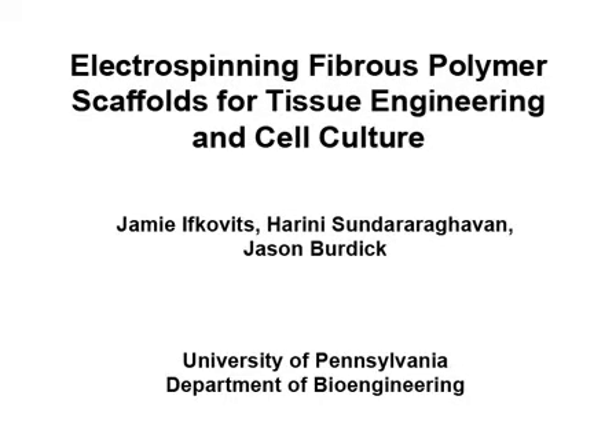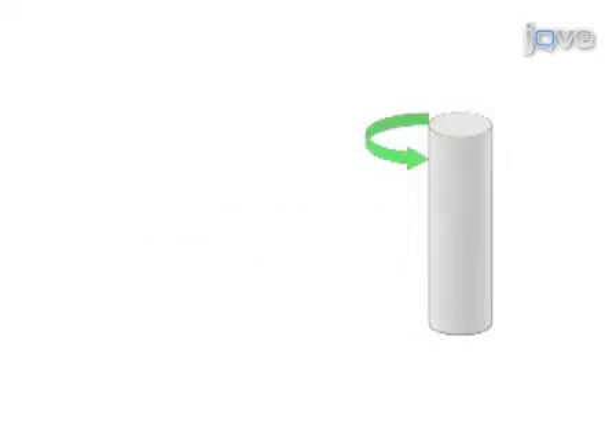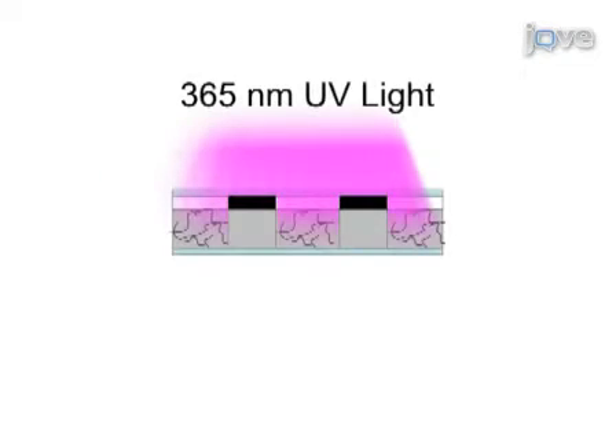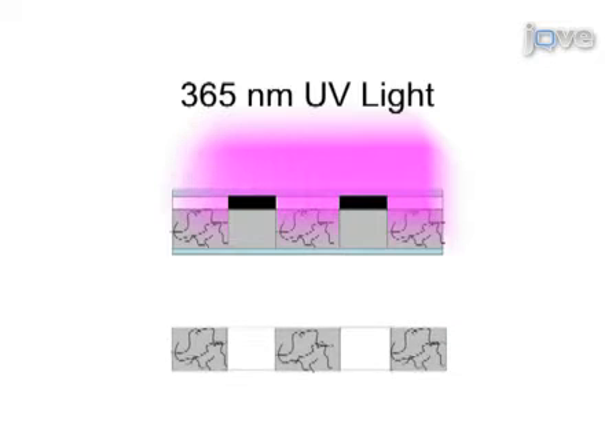This video displays electrospinning polymers, a popular technique for tissue engineering and cell culture to create fibrous scaffolds that mimic the architecture and size scale of the native extracellular matrix. Here, we electrospin a photoreactive hyaluronic acid capable of cross-linking with light exposure, and introduce further processing applications such as photopatterning, a process that creates channels in scaffolds, and multiscale porosity to increase cellular infiltration and tissue distribution.